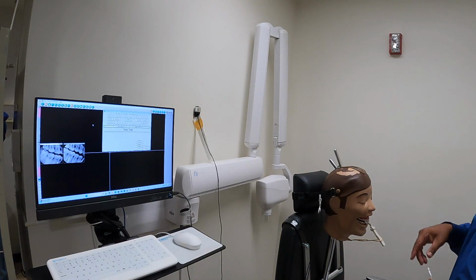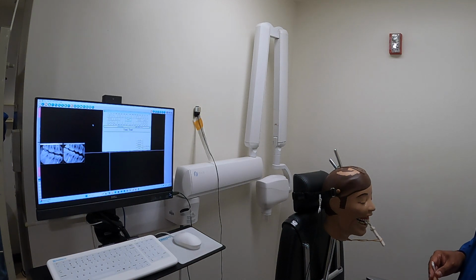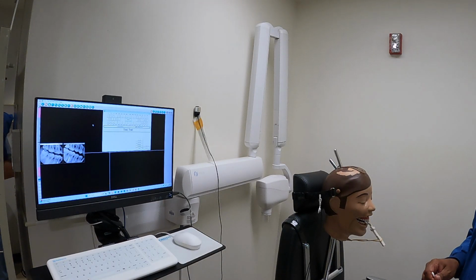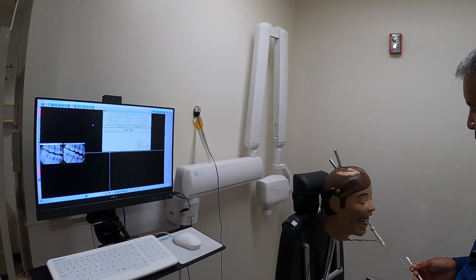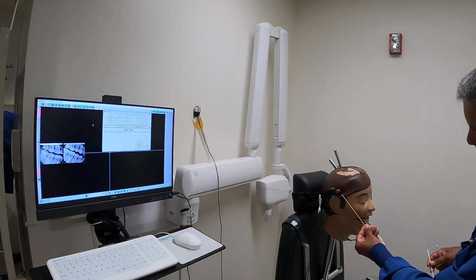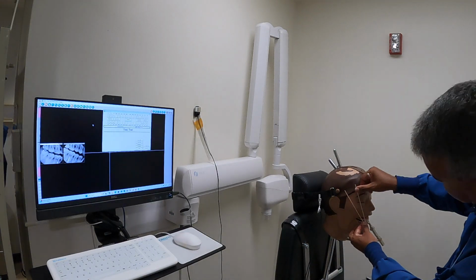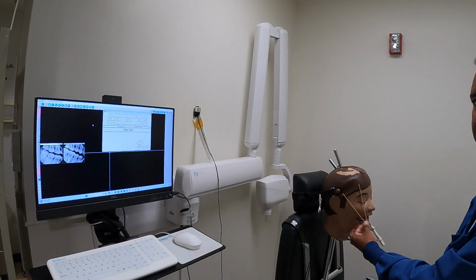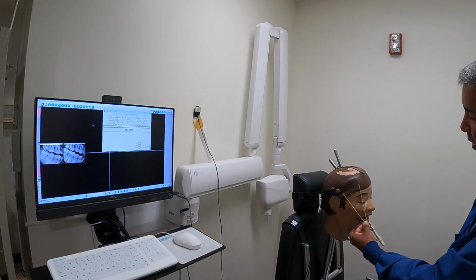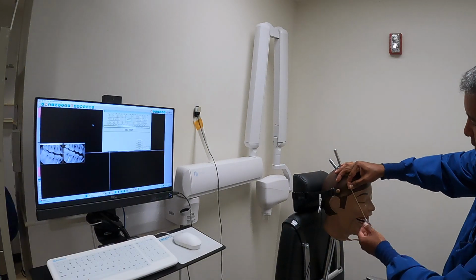For any periapical film, your biggest challenge is to find a particular imaginary line. The bisector, beautiful, the bisector. And remember that we find the bisector by doing these two things. We are splitting two angles: the angle of the film and the angle of the tooth as it goes into the patient's jaw. Those are the two angles right there. You agree? Okay, and then we said that the bisector splits those two in half equally. That is right there. So that is the bisector.